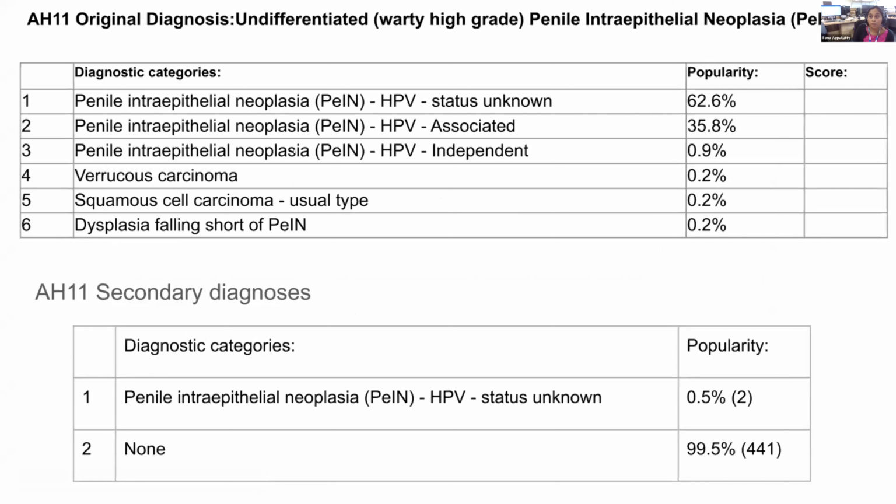So, and Dr. Oxley rightly pointed out there's recent evidence which shows that basaloid type can also be HPV negative. So without that P16, we have to combine all 3 of them and put that as one. So I hope everyone's listening. We should combine all 3 of it because of the recent evidence, because we don't have any P16. Individually, it will not score.